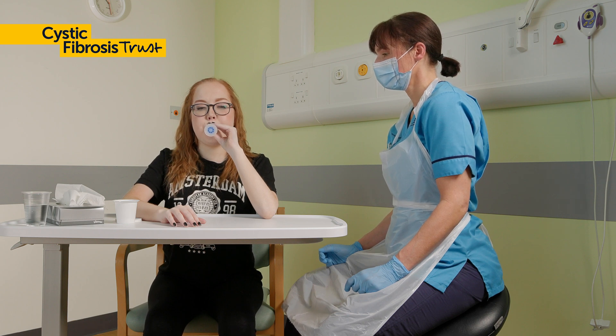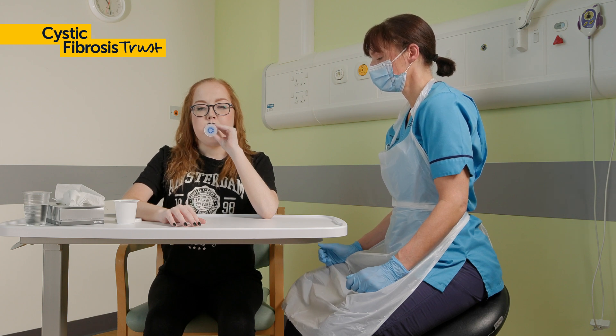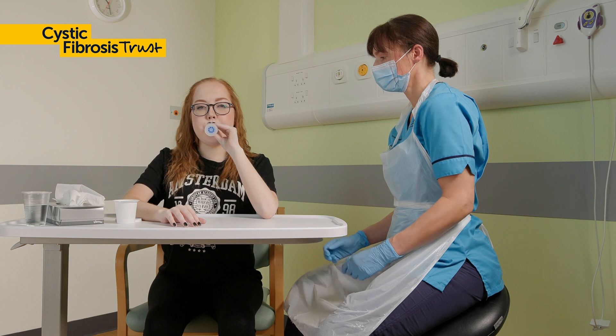Hold your breath for three seconds and then breathe out through the PEP. You will feel resistance. This creates positive pressure and holds your airways open. Your breath out should be longer than your breath in.